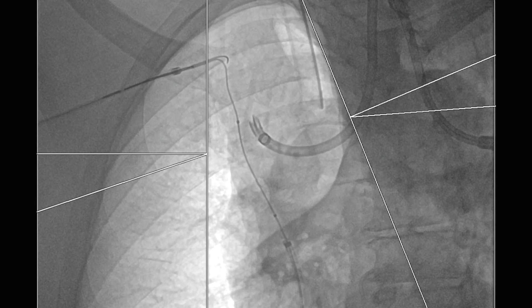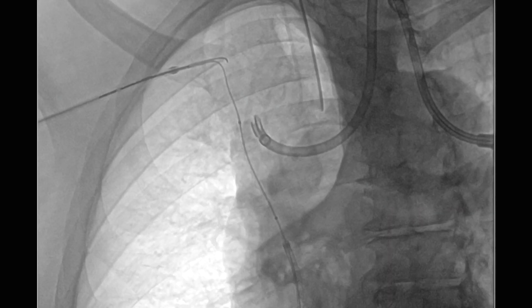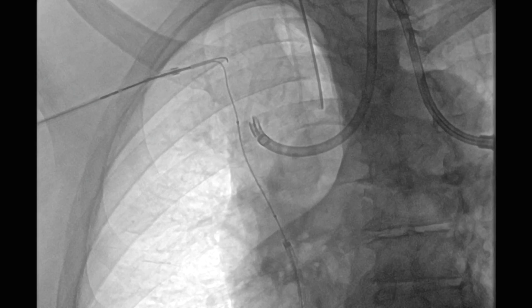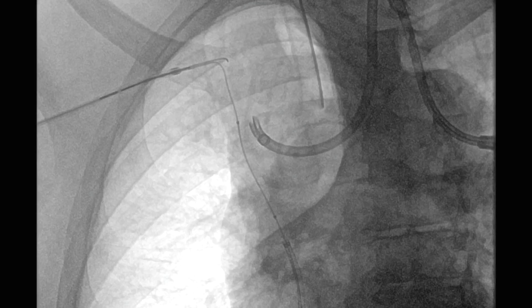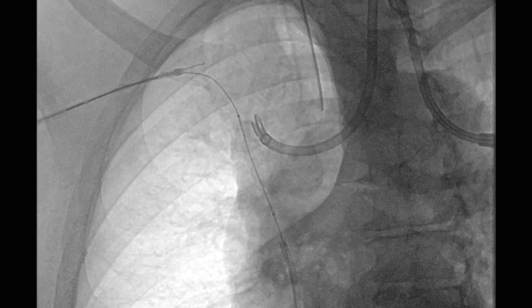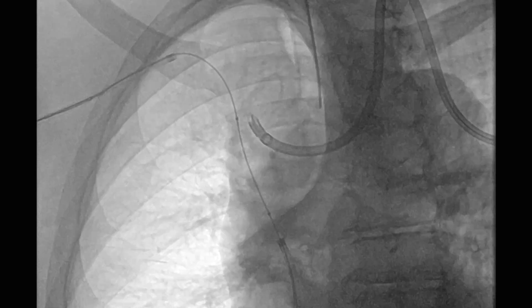Using multiple crossing catheters and wires, we were able to traverse the blockage in the superior vena cava, and using a clover snare coming from the right axillary vein, we were able to snare the wire and externalize it at both ends.